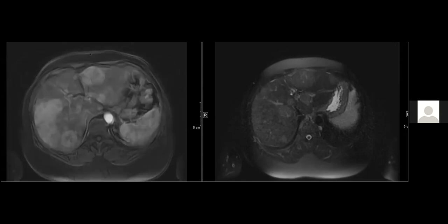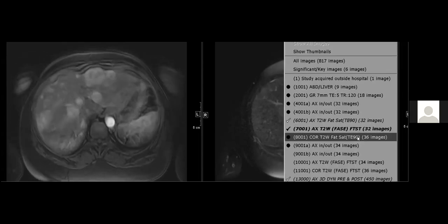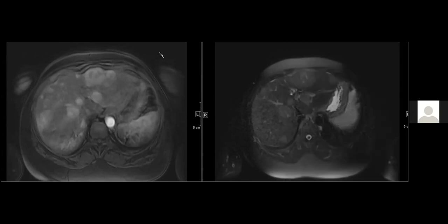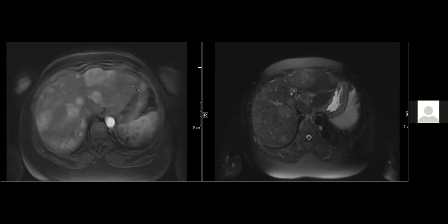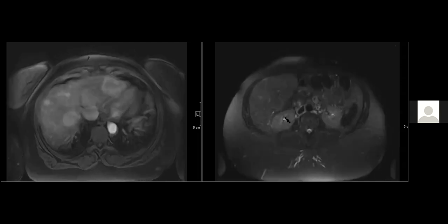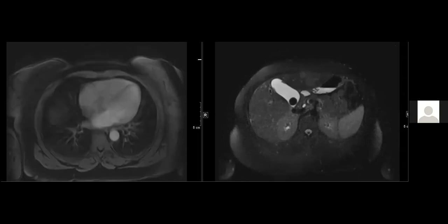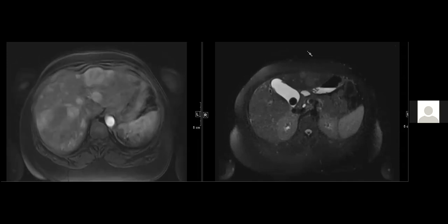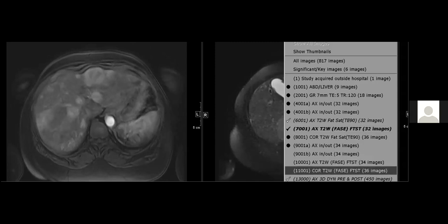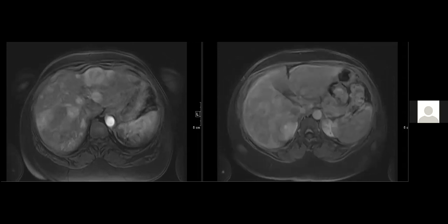My second question is, what would you think these masses to be in this patient? And would you care that the AFP is completely normal? Now, this is an outside study, so I don't have DWI to show. One thought I had: whenever I see multifocal enhancing, washing out masses, if they don't have liver disease, I always try to look for a neuroendocrine primary or other hypervascular primary. So in this patient, there's a differential, and HCC is still in the differential, and so are hypervascular mets. Appropriately, this patient was sent for biopsy, and this was all HCC.